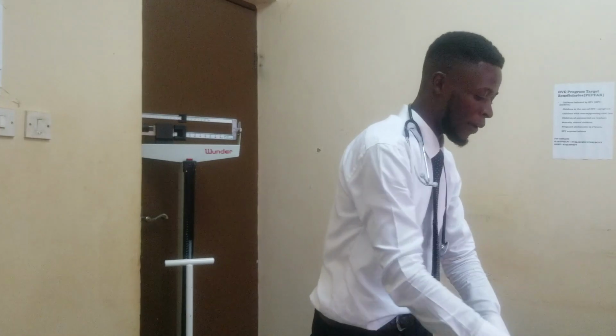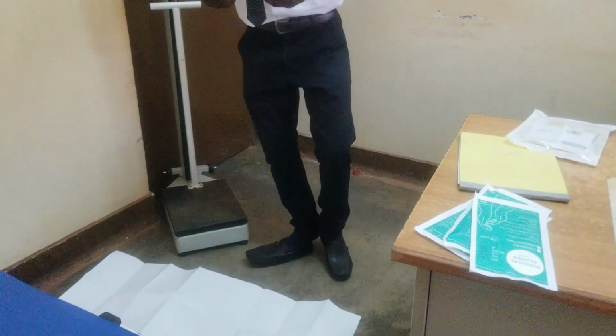So what we do, it comes with a big white paper. I unfold it. I lay it on a clean ground. So I unfold it. The one being examined stands on it and jumps over it. Then she can undress.